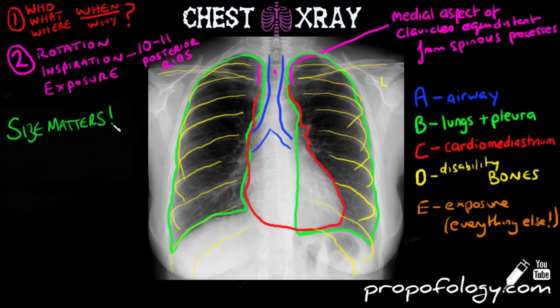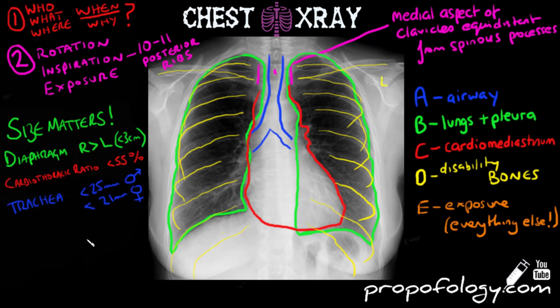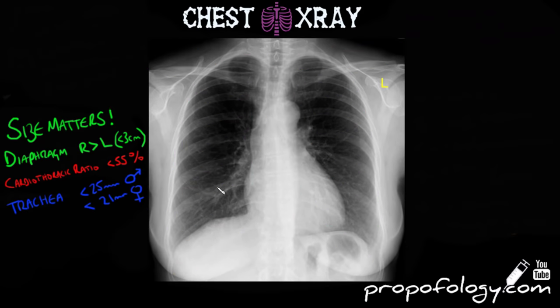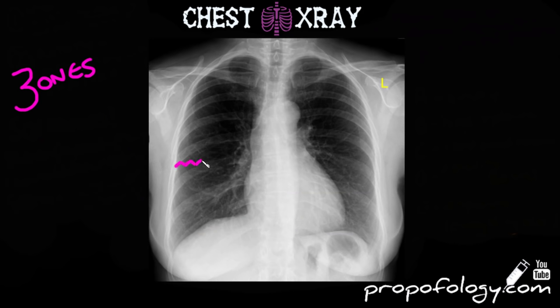Now that we've had a quick run through the x-ray, we're going to start comparing sizes of different anatomical structures. For the diaphragm, the right should be higher than the left, but by no more than three centimeters. For the heart, the cardiothoracic ratio should be less than 55%, meaning the heart should fill no more than 55% of the thoracic cavity. The trachea should be less than 25 millimeters across in a man and less than 21 millimeters in a woman. When looking at chest x-rays, you'll be examining the lung fields in the B part of your survey across their different zones.